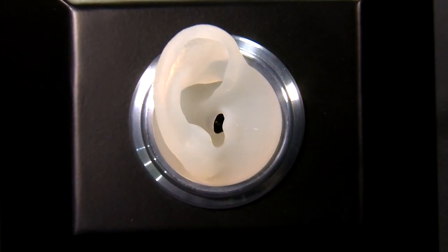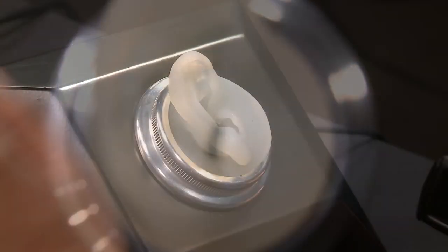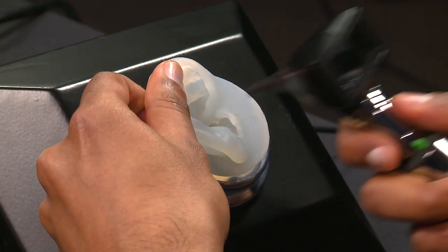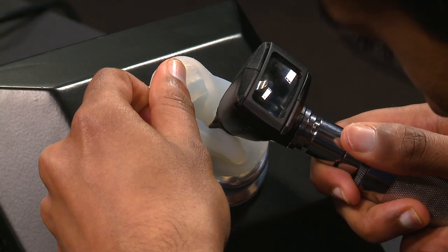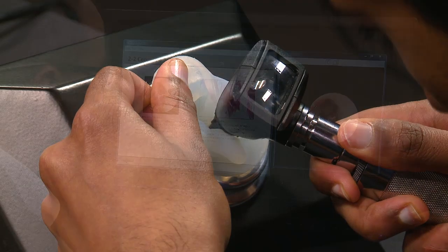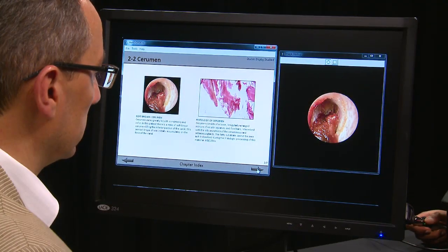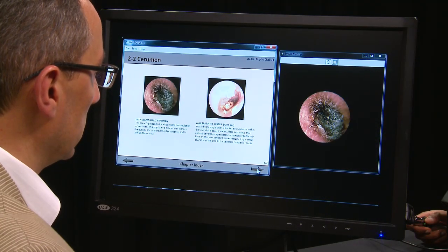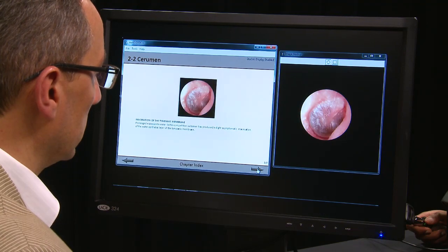We wanted to accomplish several features in a simulator. It had to be realistic. The students had to be used to using an otoscope and how to insert it into what looked like a normal ear, and then to have exposure to a wide variety of different pathologies so they could see various examples.